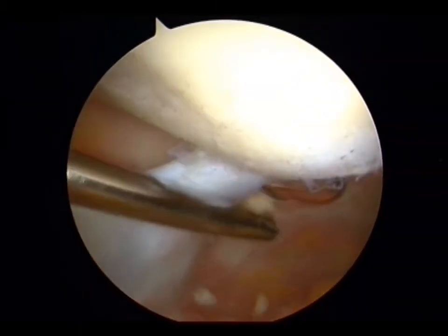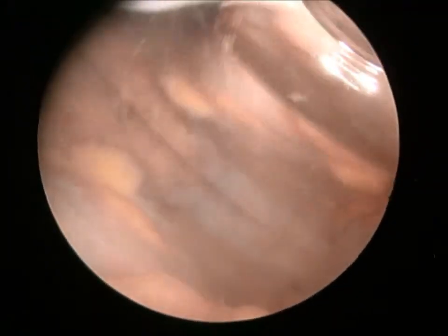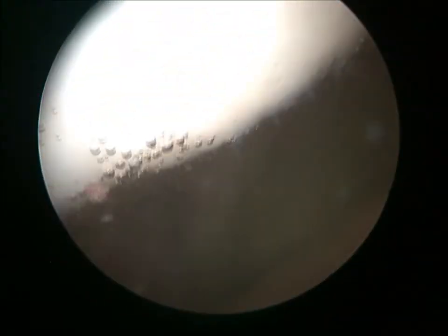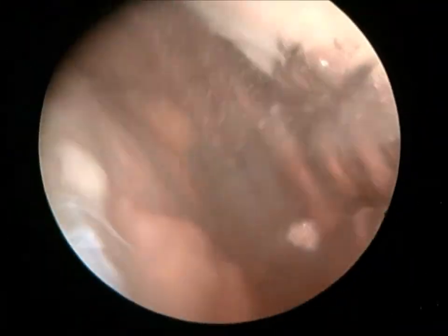And usually in this patient, I was allowed to arthroscope his knee 18 months later, and this shows the suprapatellar plica has not reformed. You can see the patella has largely recovered its cartilage — and that's without doing microfracture or anything else. I hope this helps.